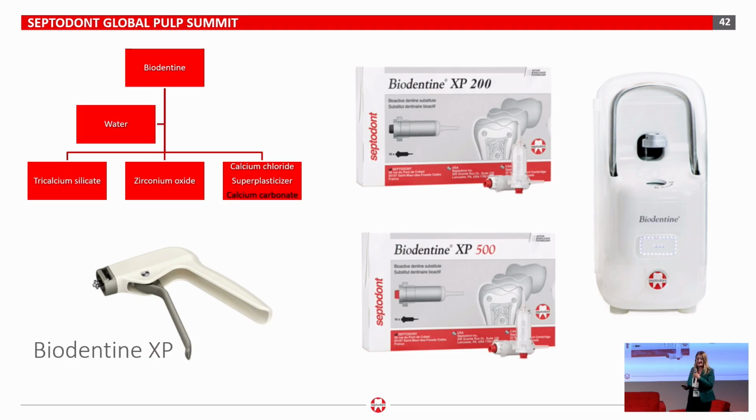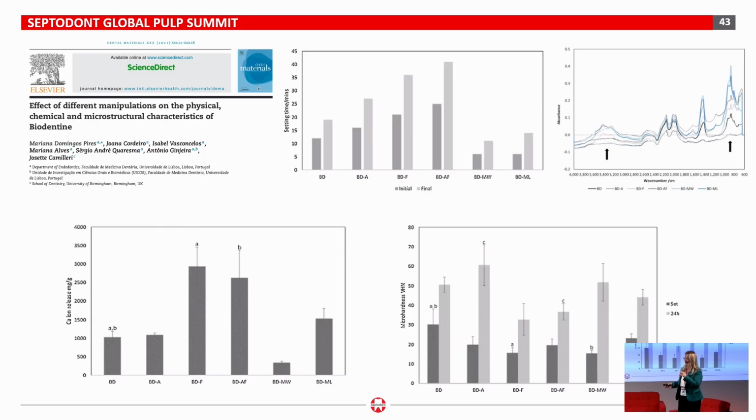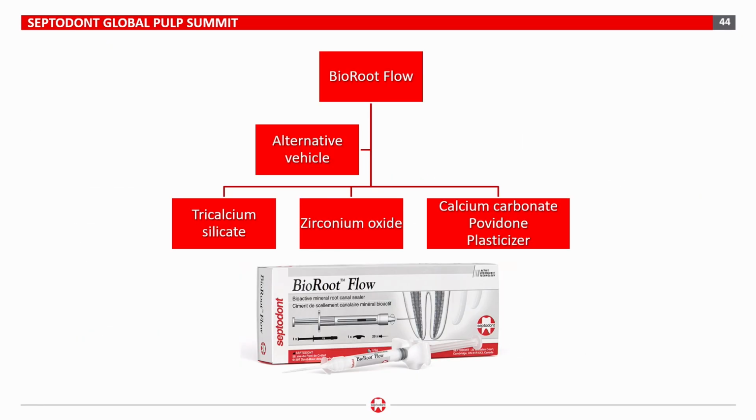We have a new mixer there, and that happened so the clinician does not abuse the material, opening the capsule, and does whatever clinicians like doing it their way, and how it works in my hands.